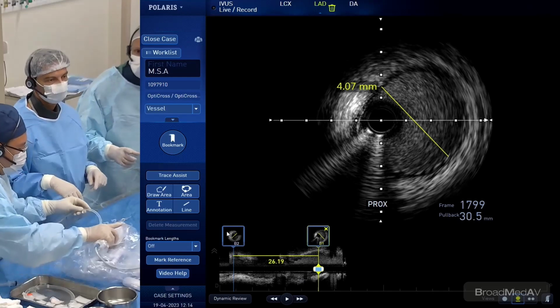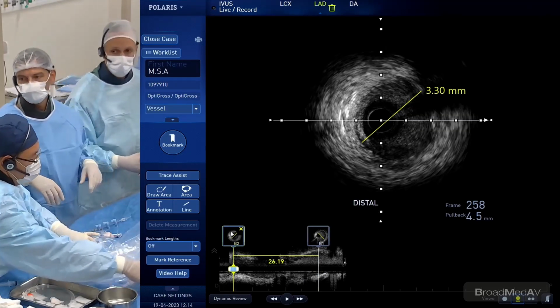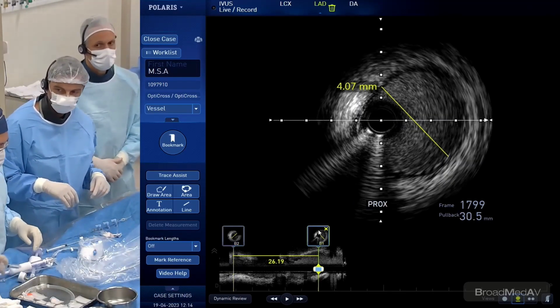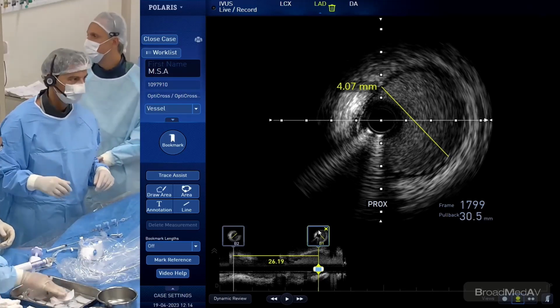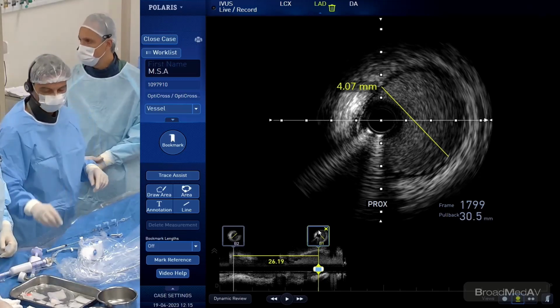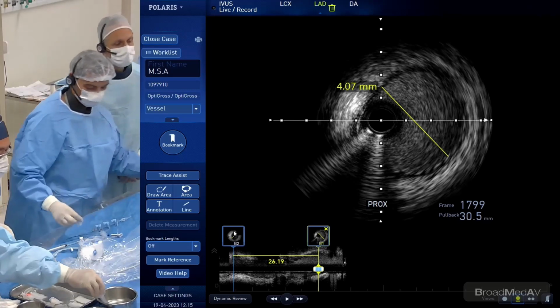Okay? So can we have the stent 3.5 by 28, please? Yes. We are choosing 3.5 by 28 because you don't want to touch with a 4.0 in the distal part of the artery, to avoid dissection. To avoid disease there, but that's a good landing zone.